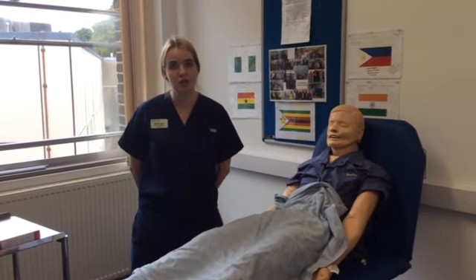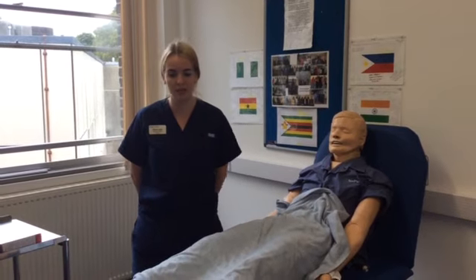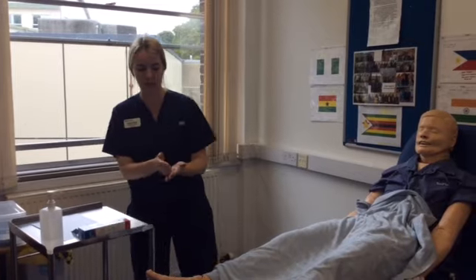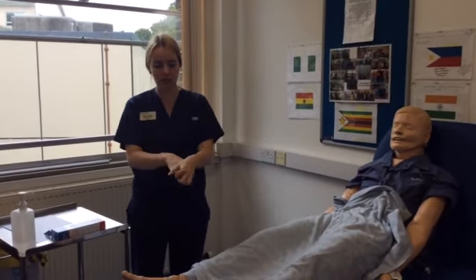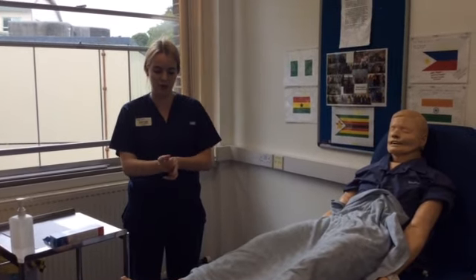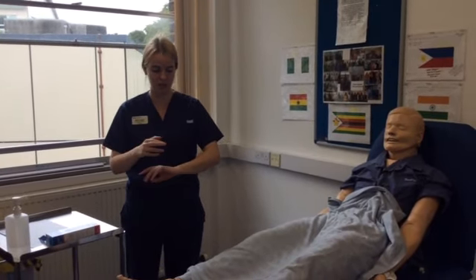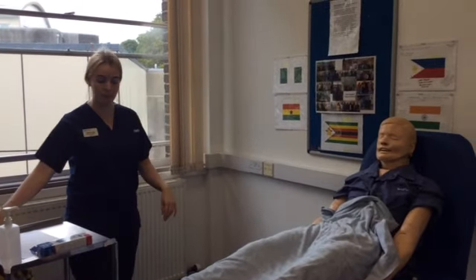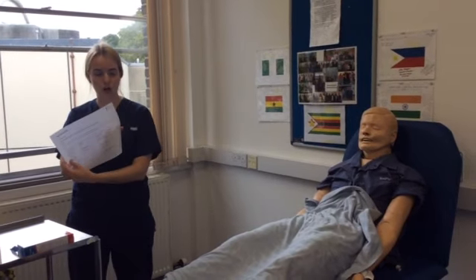So I'm now going to demonstrate the administration of a metered dose inhaler for the OSCE exam. Before I approach my patient, first I'm going to decontaminate my hands using hand gel, fingers interlaced, back of hands, fingernails, thumbs, centre of the palms and wrists. I'm going to check my environment is safe, and then I'm going to go to my patient. I'm also going to take my drug chart with me.